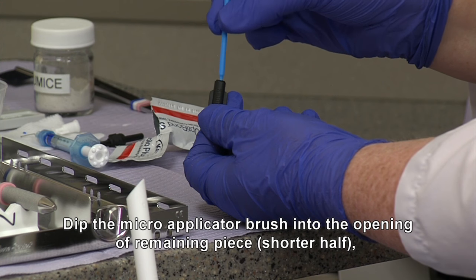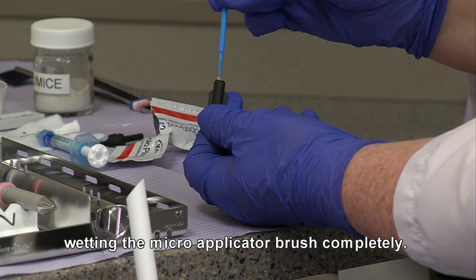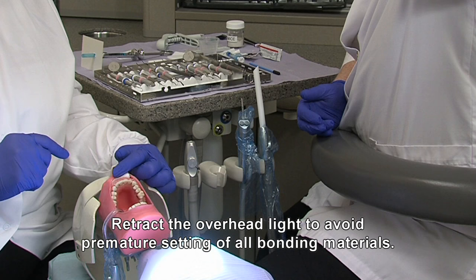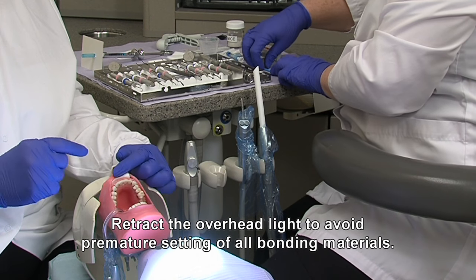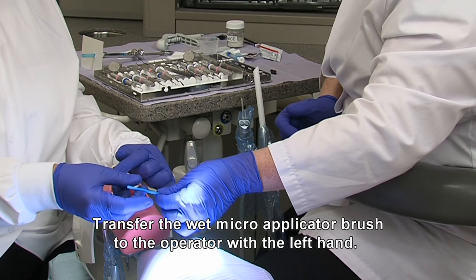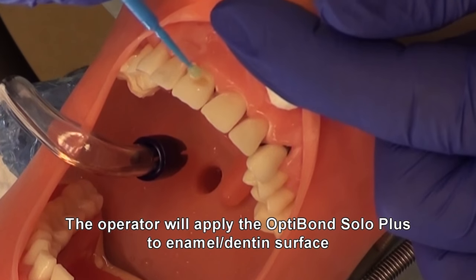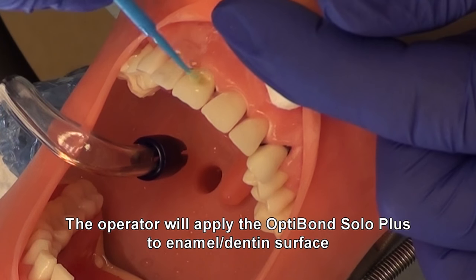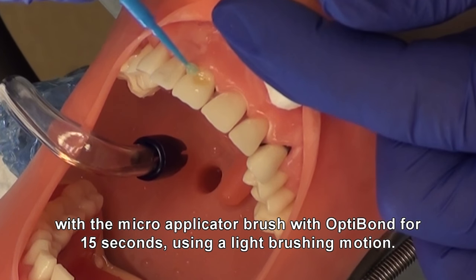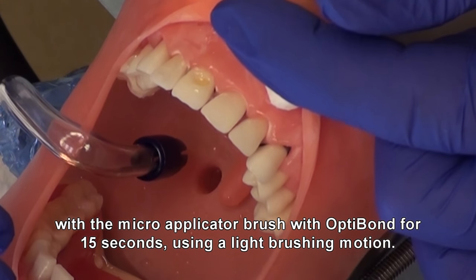Dip the microapplicator brush into the opening of the remaining piece, the shorter half, wetting the microapplicator brush completely. Retract the overhead light to avoid premature setting of all bonding materials. Transfer the wet microapplicator brush to the operator with the left hand. The operator will apply the OptiBond Solo Plus to the enamel dentin surface with the microapplicator brush for 15 seconds, using a light brushing motion.